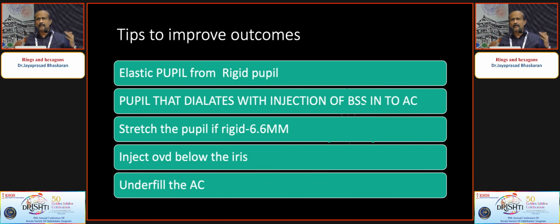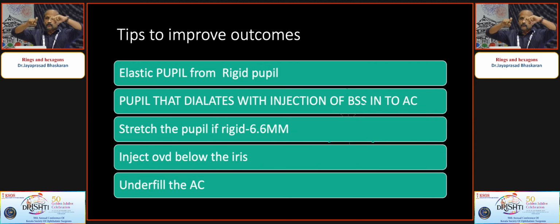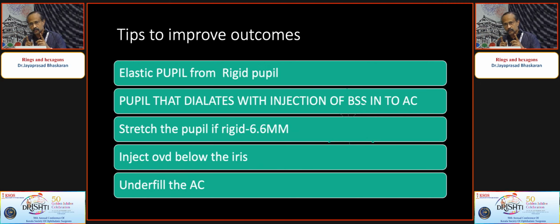Now, stretching, unlike what you do routinely, only means you stretch to the limbus. But here, if you are stretching, you stretch only to 6.5 or 7 mm: 1, 2, 3, and 4. Four stretches you should do. Very minimal stretches, so that you will have only very small tears, so that the pupil will remain round, even come back to normal and react.